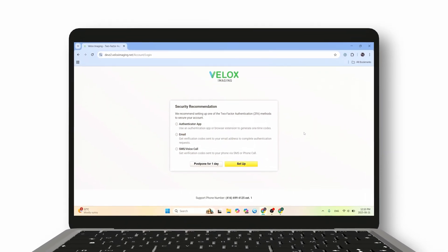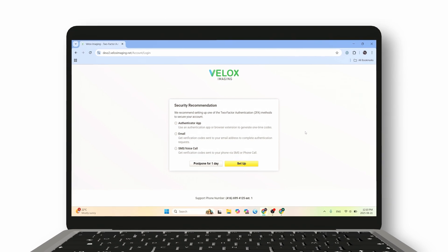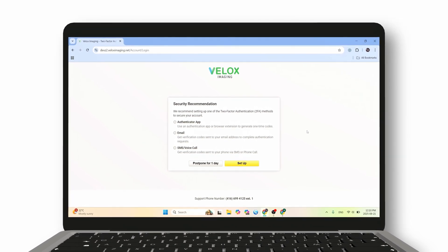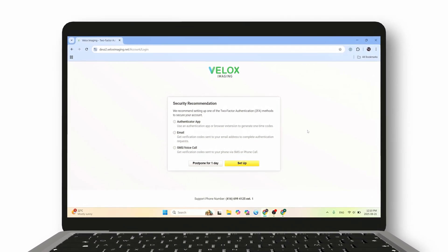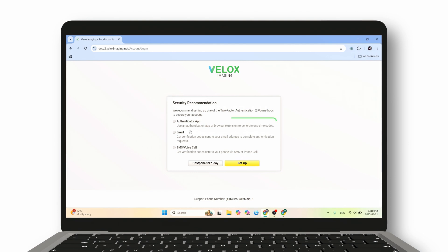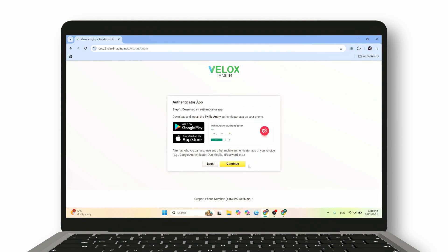Now, when you log into the system through your browser, you'll see a few options for 2-Factor Authentication. While any of these methods will improve your security, we highly recommend using the Authenticator app. It's by far the most reliable and secure option.